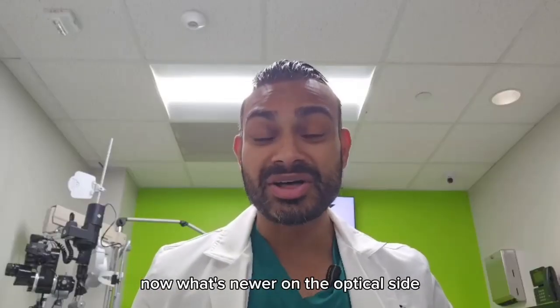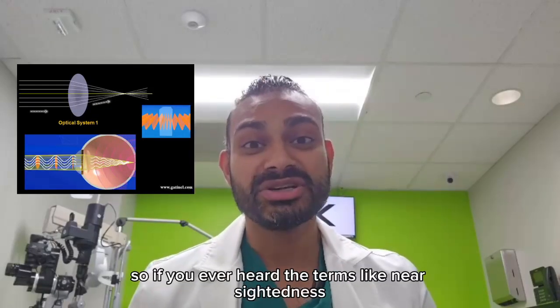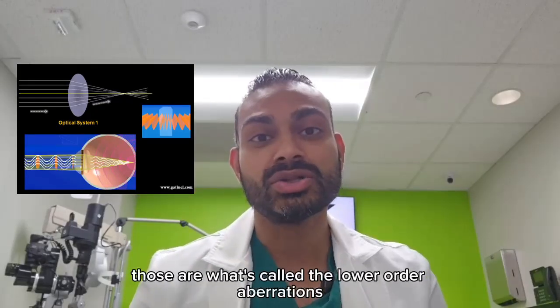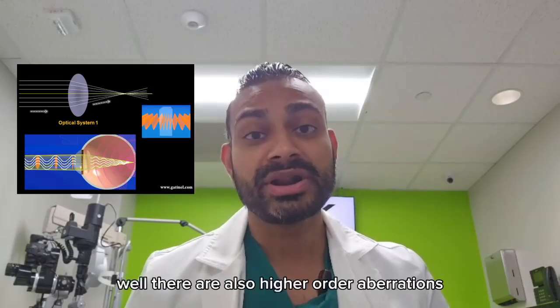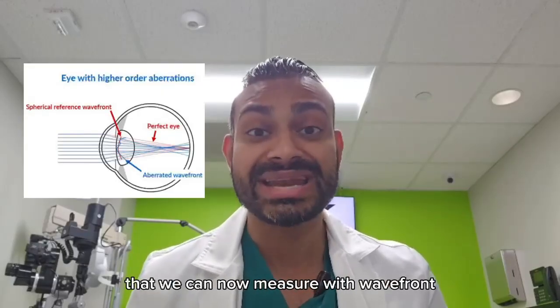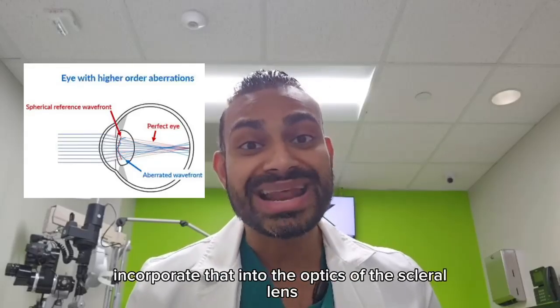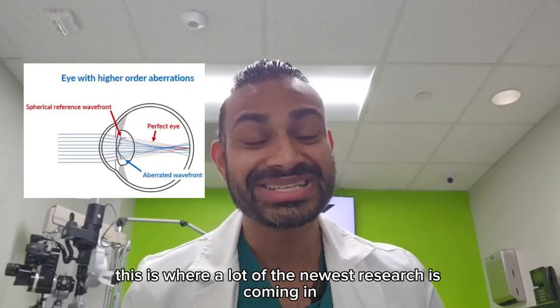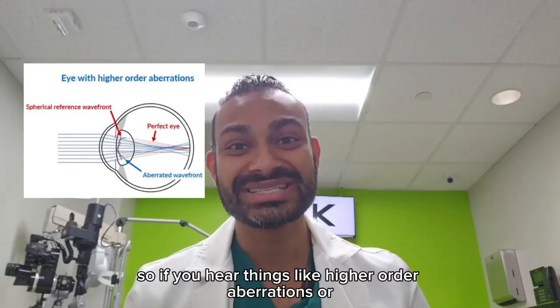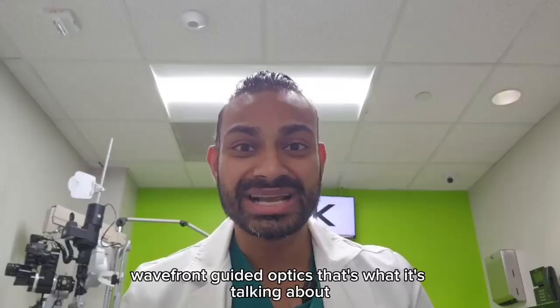Now, what's newer on the optical side is adding wavefront optics. So if you ever heard the terms like nearsightedness, farsightedness, astigmatism, those are what's called the lower order aberrations. Well, there are also higher order aberrations which go beyond that we can now measure with wavefront guided instruments and then incorporate that into the optics of the scleral lens. This is where a lot of the newest research is coming into scleral lenses. So if you hear things like higher order aberrations or wavefront guided optics, that's what it's talking about.